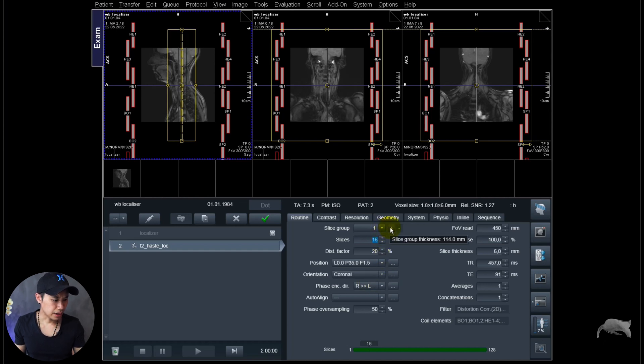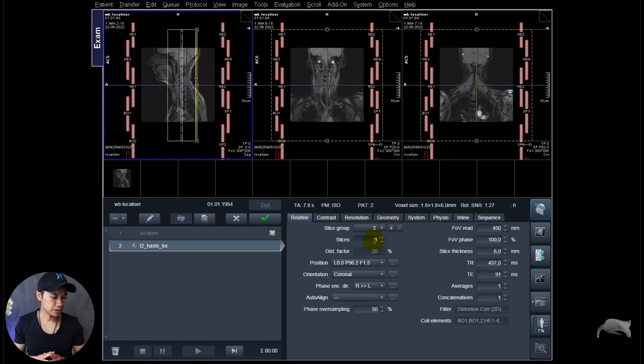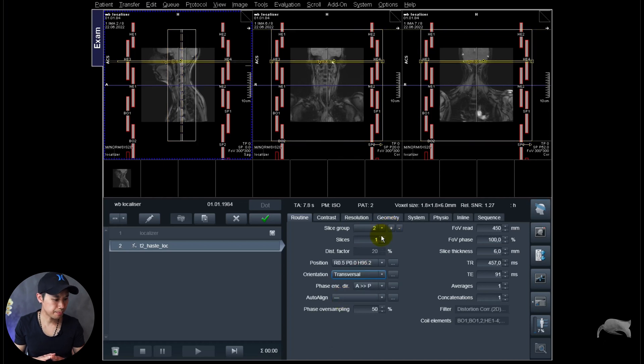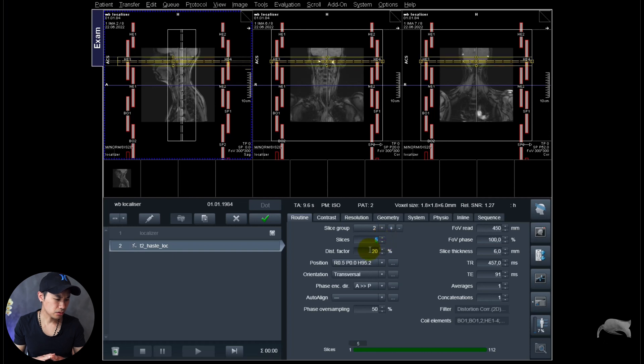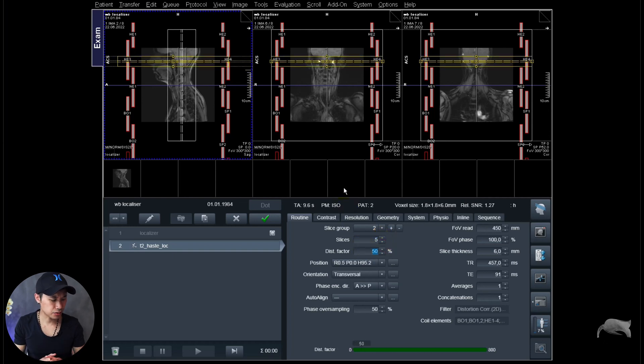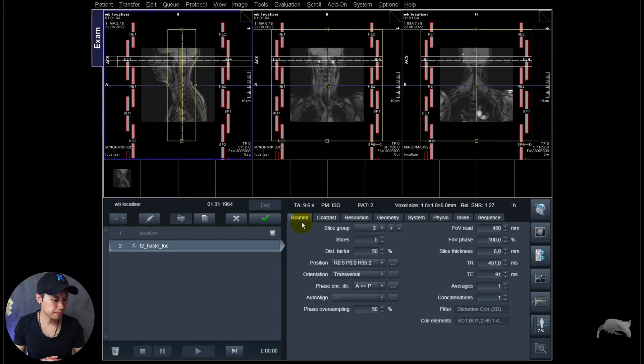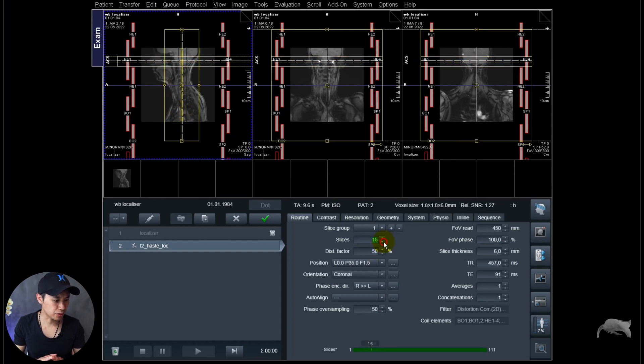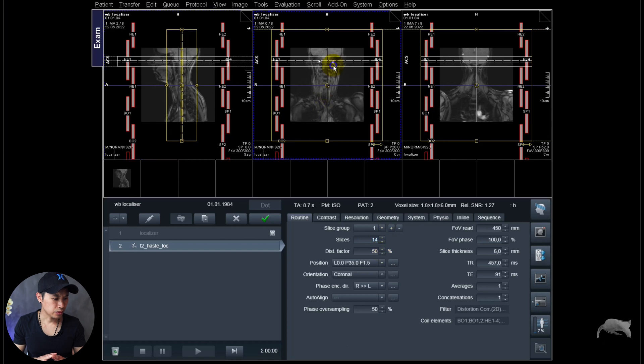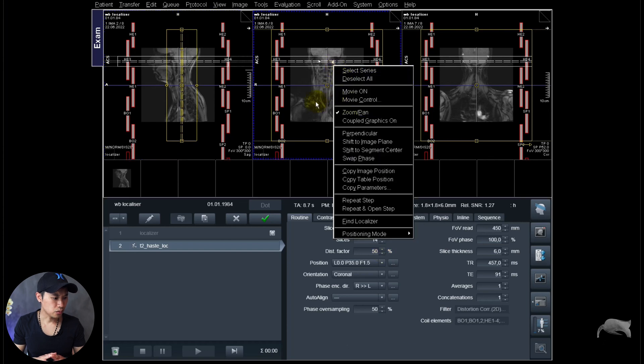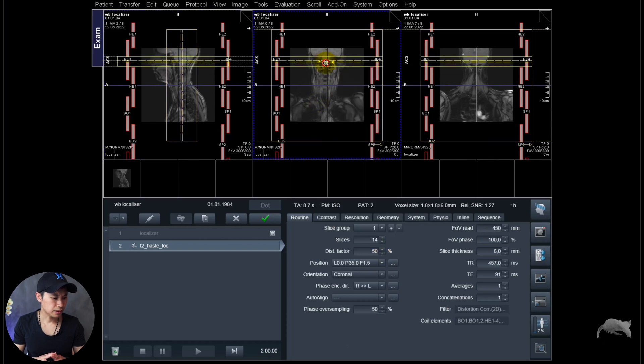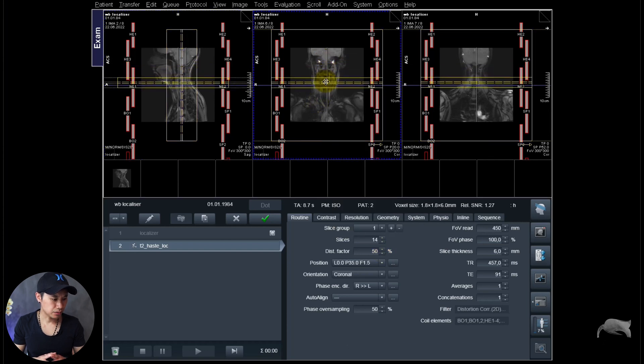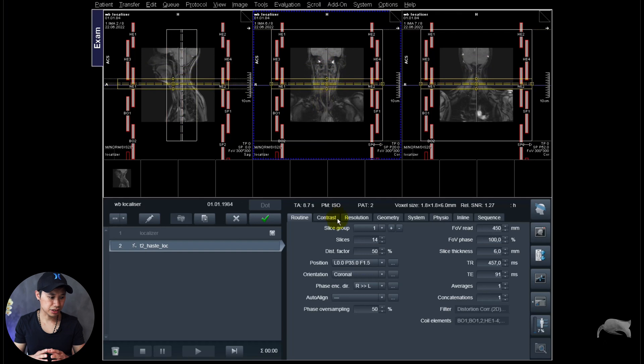And then add another slice group right here. So this one I will make in transversal. Add a little bit slices here, also distance factor. I just want to cover a little bit more, also distance factor 50 here for the coronal.